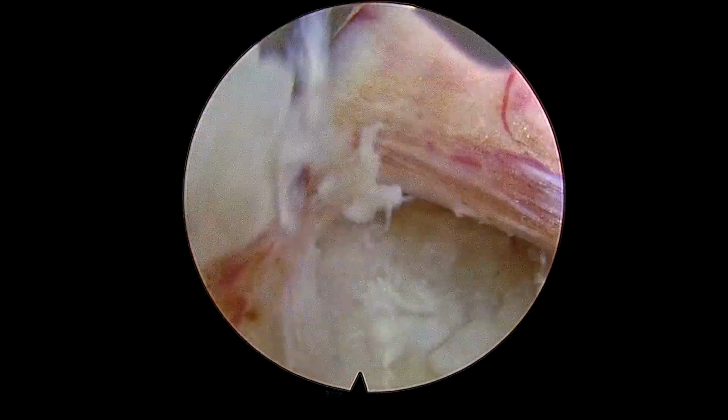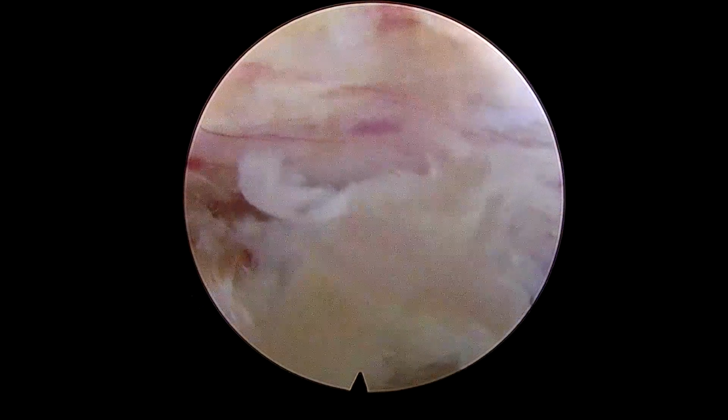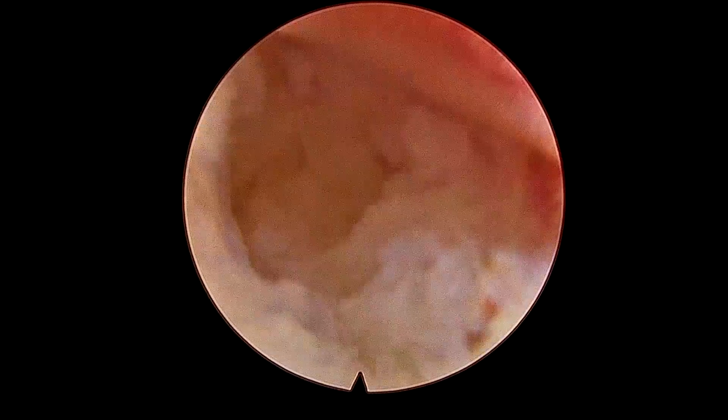If you do so, you have to remove the pressure on the nerve root frequently. Once I take a few bites, I'll just release the pressure and then again retract it medially. These are all free fragments which are coming from the disc space. You can see here, this was again a big fragment which came out.